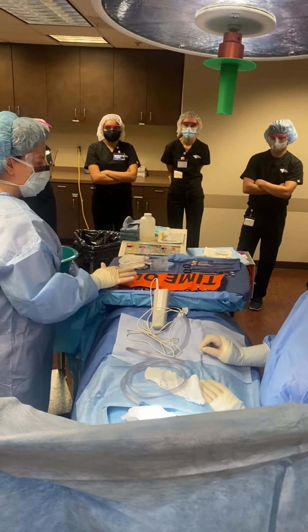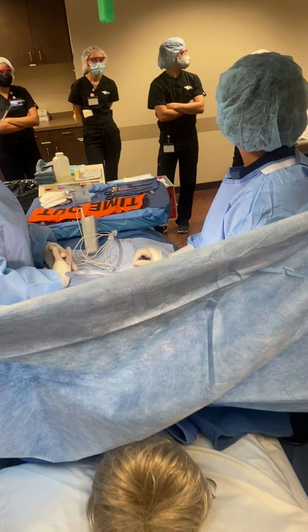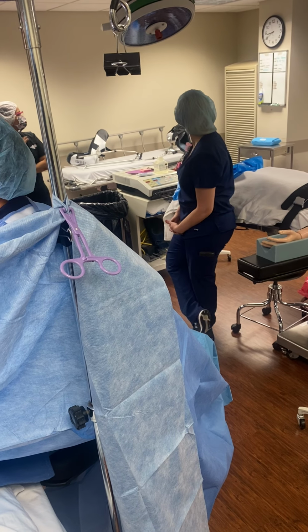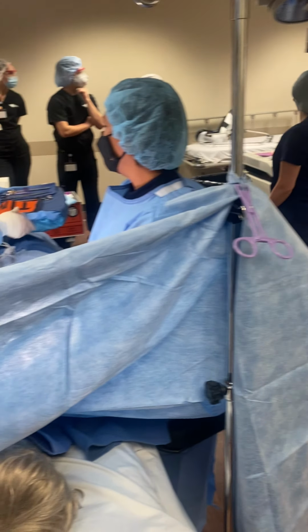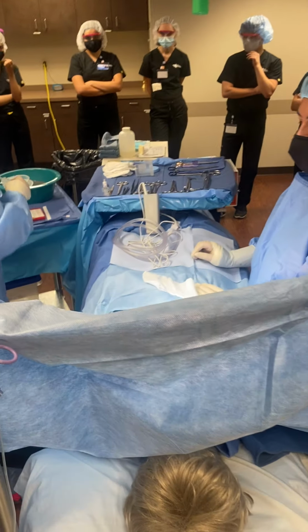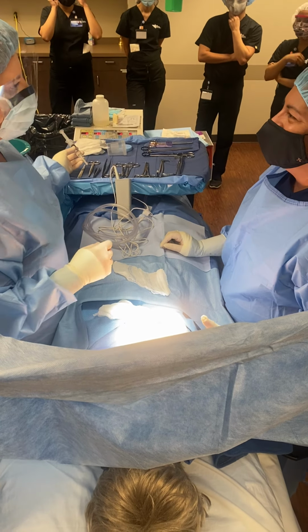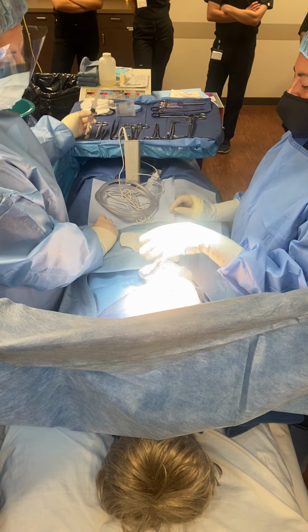All we have to do is our timeout. So our patient is Viv Aikens, and the date of birth is 8/21/64. We're doing a right breast biopsy and no known drug allergies. Awesome. The right side is the correct side. Okay, I agree. Do you guys agree?